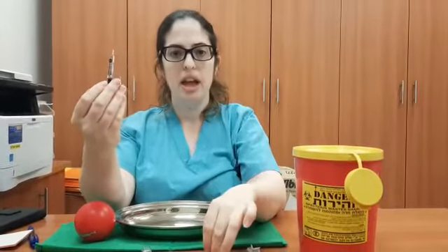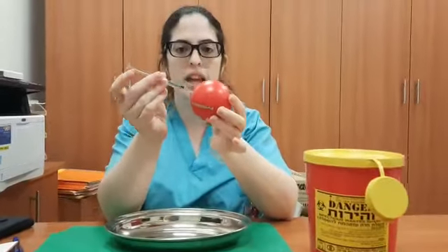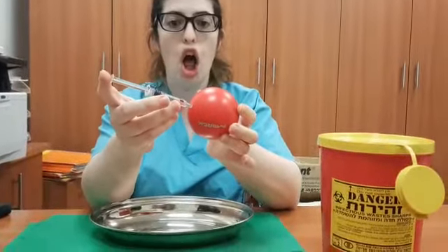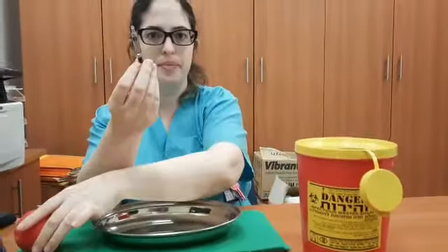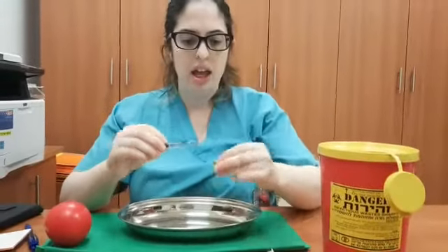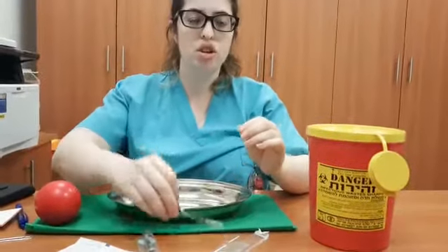Take the cap off and on the navel line put the injection in and press all the way till it's empty. If you have any problems please call the nurse's station during working hours. Good luck.